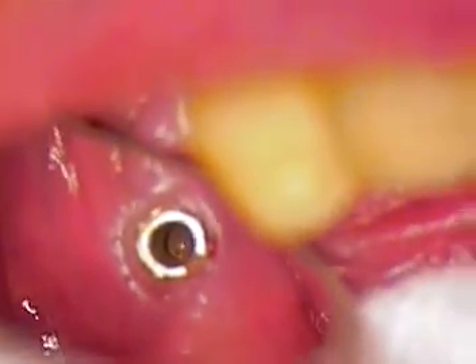We'll keep that piece. Now I'm looking straight down, so I'm going to go ahead and add that fluid again. This way we can clean all the inside of this out completely. I've got some impression copings so we can give him something to use, as well as my healing abutments — they can go in there and keep that tissue from closing in. So I'm going to leave that solution in there to let it soak, and let's move on to the other one.